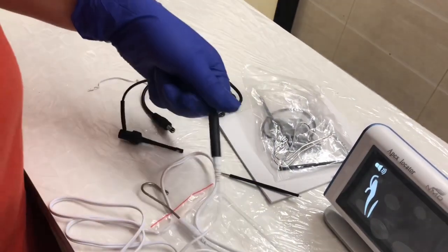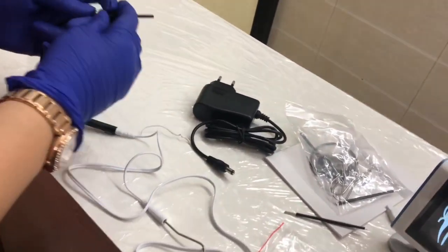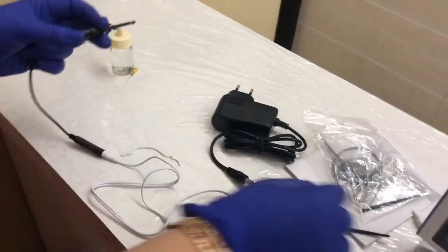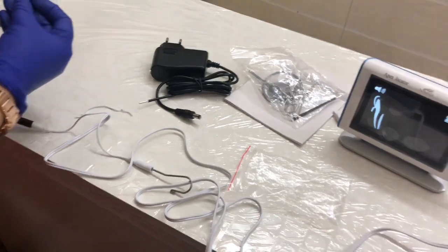You can even use your touch probe instead of the file clip — for example, when you are doing molar hooks and it's inconvenient to place the file clip, you can use this touch probe. Now I am going to hold this file.